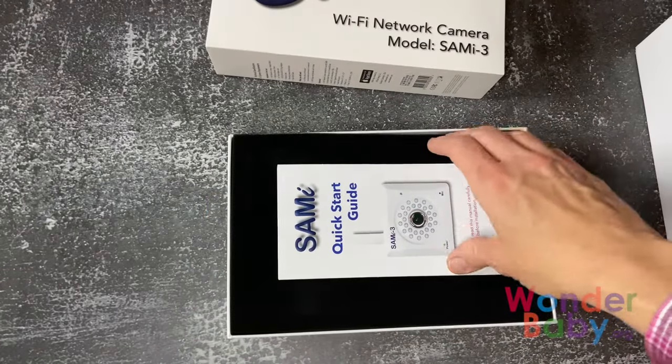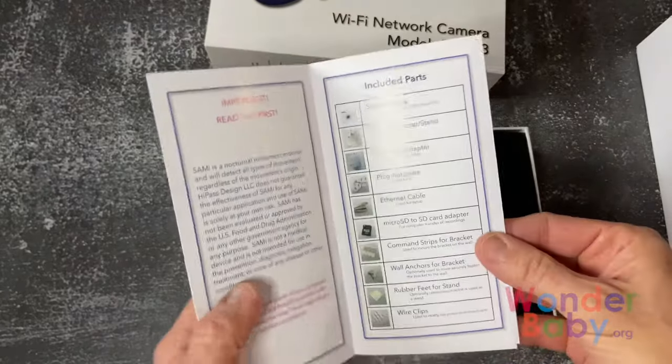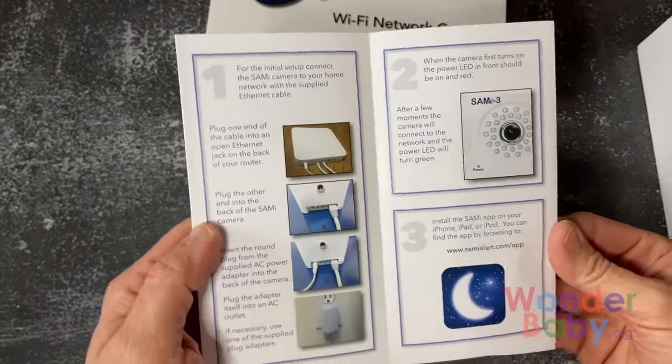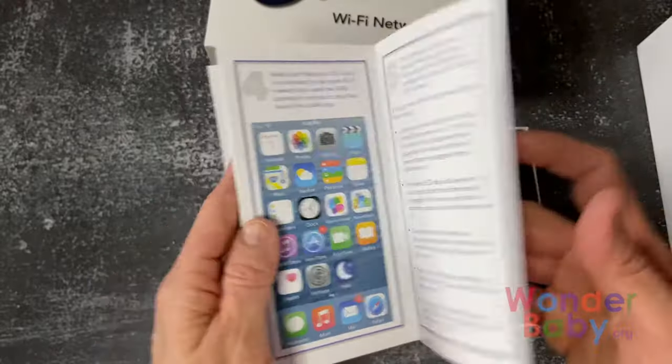Opening the box, the first thing we get is the SAMI quick start guide, which is really well written. It has a nice big picture so it's really easy to follow and easy to use.